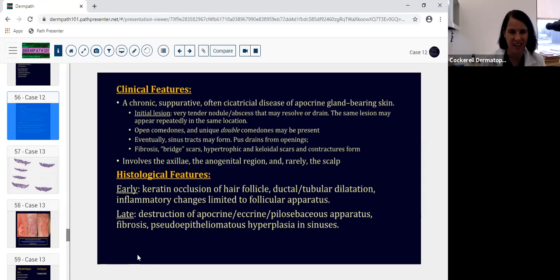Hidradenitis, if you culture it, unless it's opened externally, maybe you could find something in there, but typically they're negative. We did see the foreign body reaction to the keratin, so we'll say there's a foreign body reaction, and it's to keratin, which I don't like that term, foreign body reaction. I like granulomatous, but we use it all the time. And then it's part of the occlusion triad. So we can definitely move on to the next case.